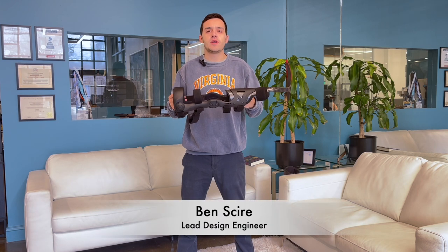Hi, I'm Ben, lead engineer here at Icarus Medical, and I'm here to talk to you about our new Hercules CAFO.